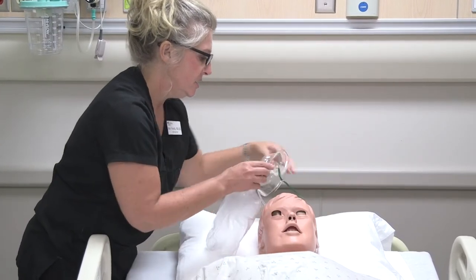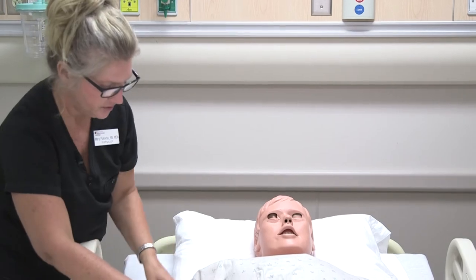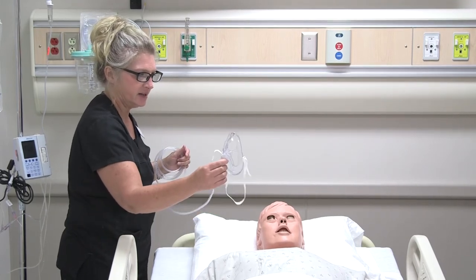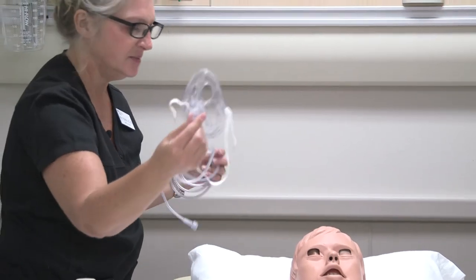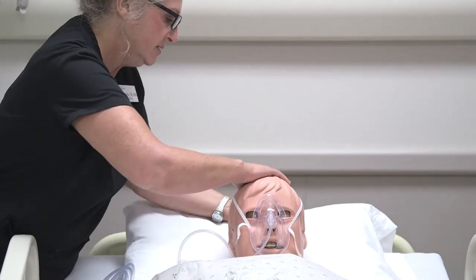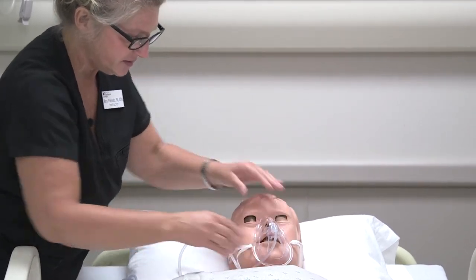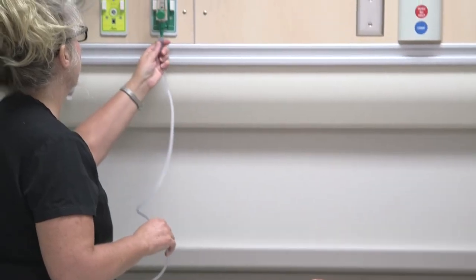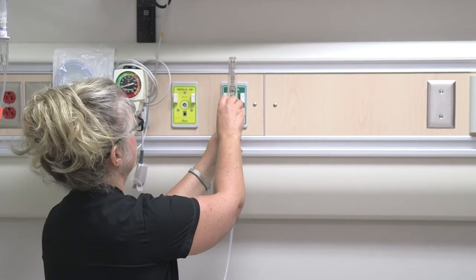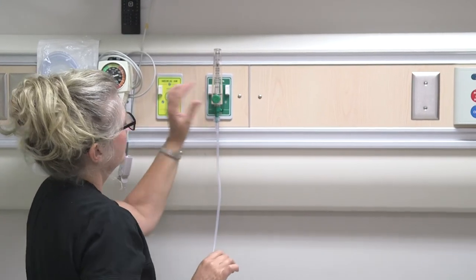Finally, we'll do the Oxy mask. The Oxy mask is a little different in that you do see openings in it, so you do have that exchange of oxygen and carbon dioxide. It kind of looks like it's missing pieces, but that's how it's meant to be. This is placed just like a regular simple mask. It is a little more comfortable because it is a little more flexible. The level of oxygen you can set this one at is anywhere from one to fifteen, and the FiO2 can go up to almost 80% with this one as well.